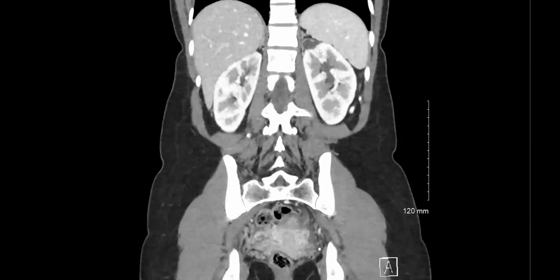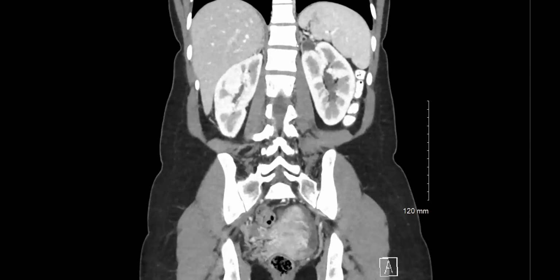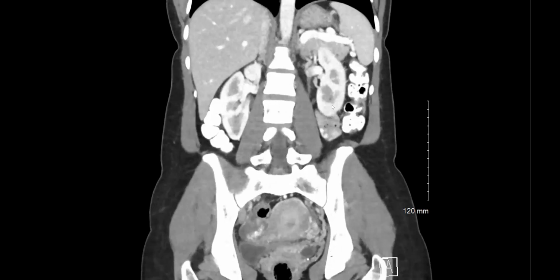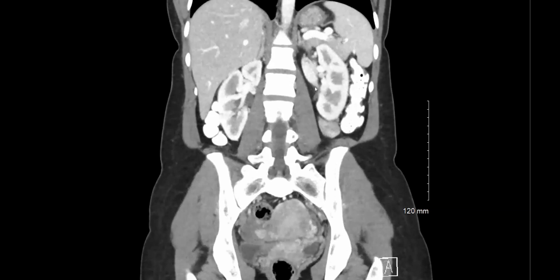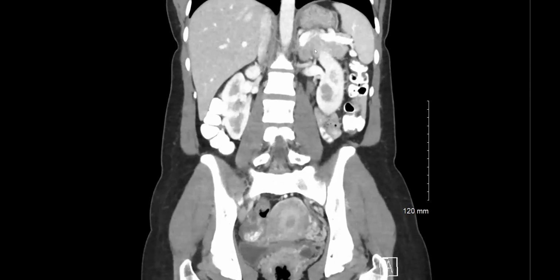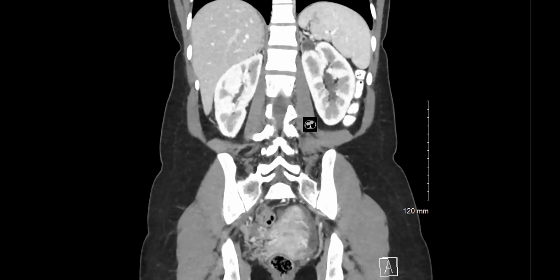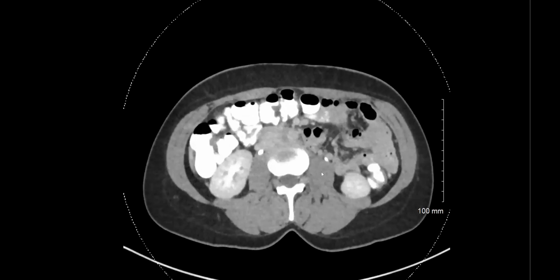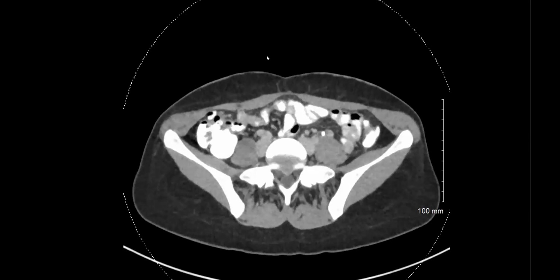No, you're absolutely spot on. So on the post contrast images, you can see that there is a cystic structure up there. Automatically you're thinking of the Weigert-Meyer rule and looking for a duplex moiety with this kind of VCUG finding. So indeed, she has an atrophic upper pole and an almost normal appearing lower pole. But the interesting part is, according to the Weigert-Meyer law, it's usually the upper pole that is ectopic, obstructed, and atrophic. So here, this is atrophic, but unfortunately, this is an outside CT, the delayed phase stops short and doesn't really go down all the way.